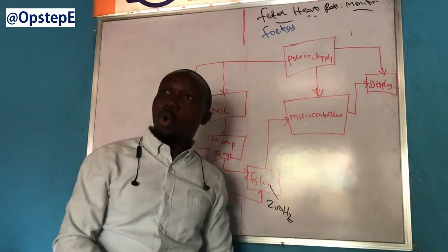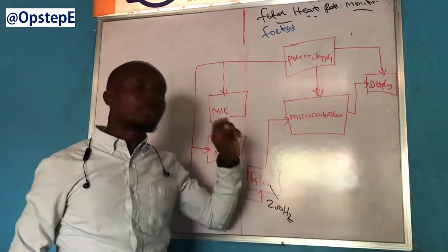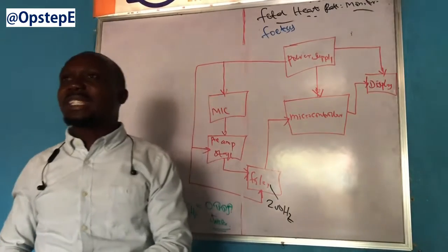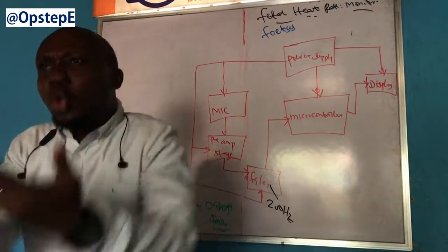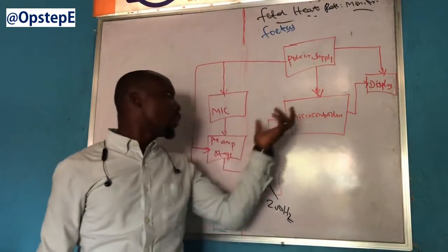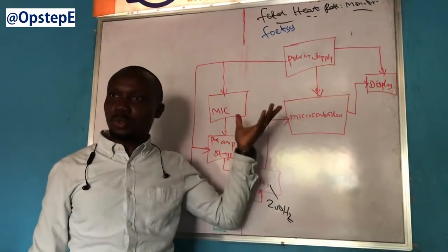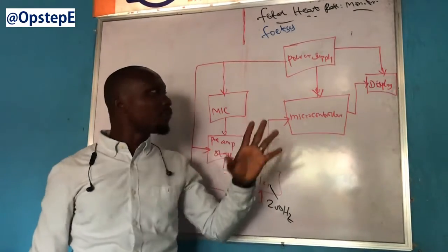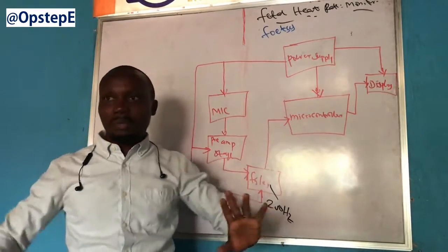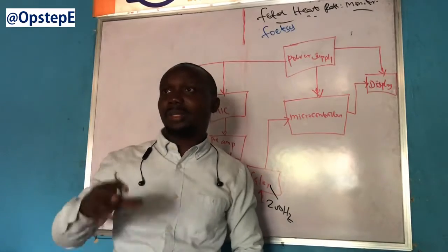There needs to be a way, unless we can say maybe after this filter, we send this sound again into another system that can help us digitalize it. But if it digitalizes this for us, then it has done the work for us. What I'm trying to say in essence is this: whatever I'm going to be explaining now is how your project is supposed to be, but it will not stop you from manipulating the hardware, bringing other things in to have a result. And I'm so glad you've been able to give me that number of weeks to do that, and the privilege to do so.